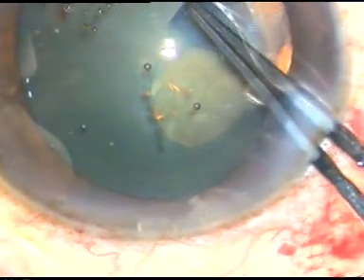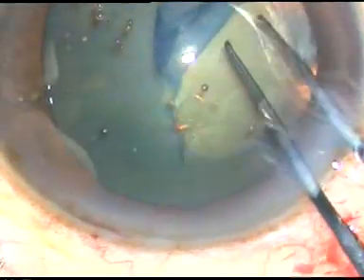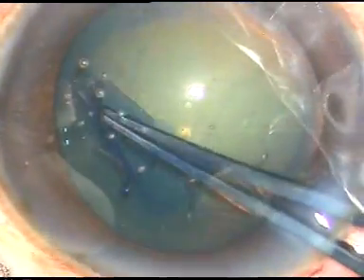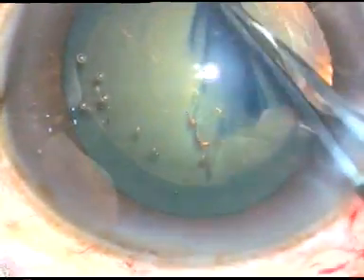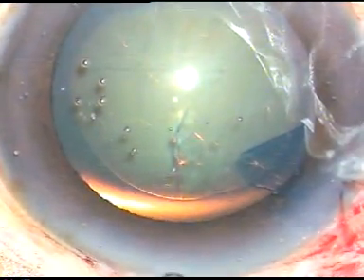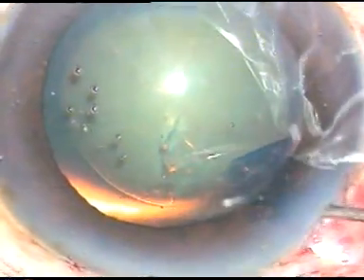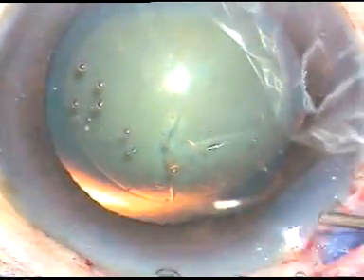I go anticlockwise and do a CCC — a continuous curvilinear capsulorhexis. This is not a perfectly circular rhexis, but this is a fairly acceptable large rhexis. Now hydrodissection is done; the posterior lip is depressed and some amount of viscoelastic comes out.